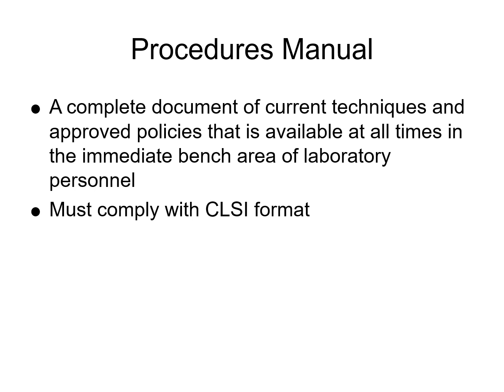Best practices for this: we want to regularly review and update the document to include any new serology techniques, any changes in the regulatory policies, or if there's been any updated QC or safety procedures. We're also going to train all personnel to familiarize themselves with the document, and we're going to maintain a physical or digital copy in the bench area that is easily accessible to everyone.